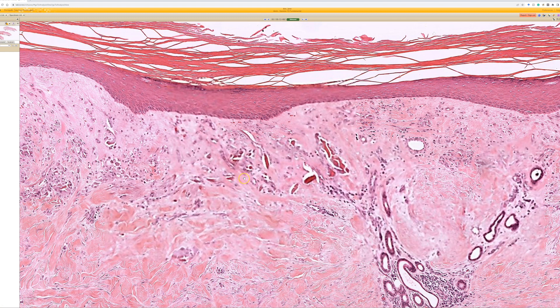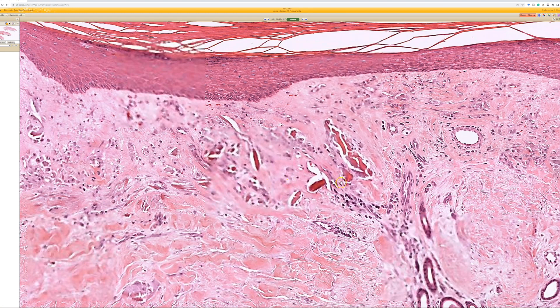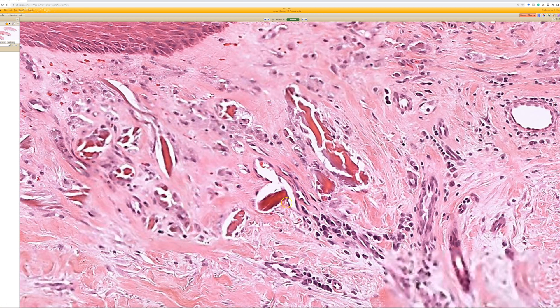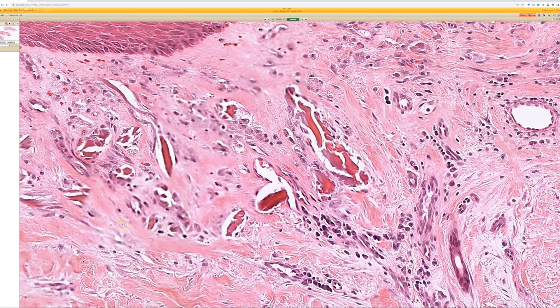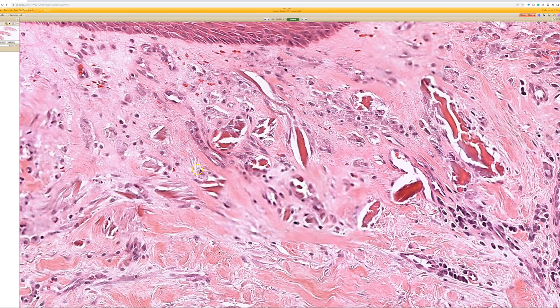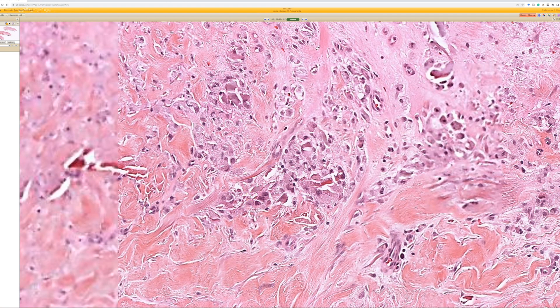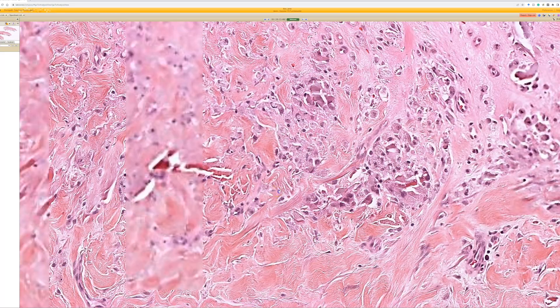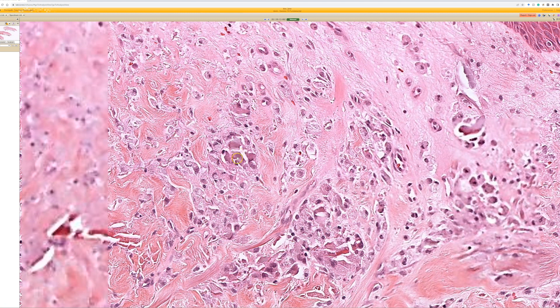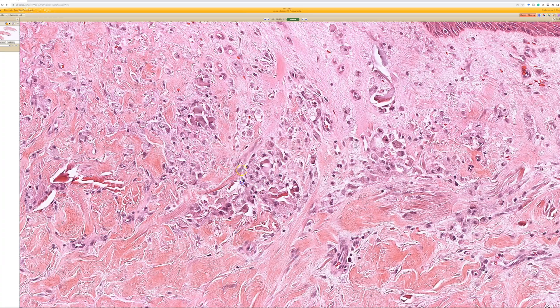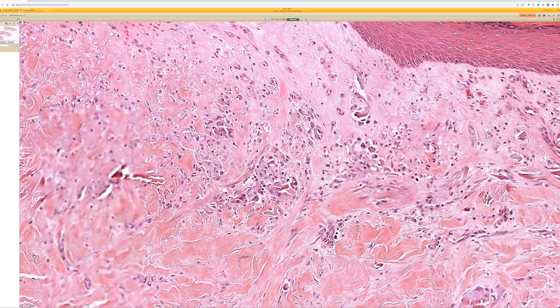What happens is you get these distorted, discolored, calcified collagen fibers. The collagen gets kind of squished, homogenized, and smudgy looking, turning a darker reddish or purple color. All of these weird-looking fragments are fragments of chemically burned and calcified collagen fibers from the aluminum chloride - you can see them starting to turn purple, with fragments of calcification throughout.